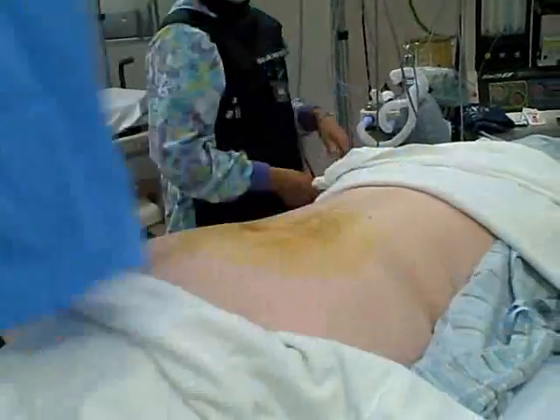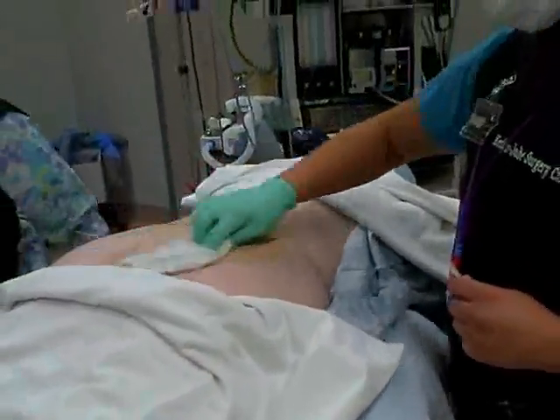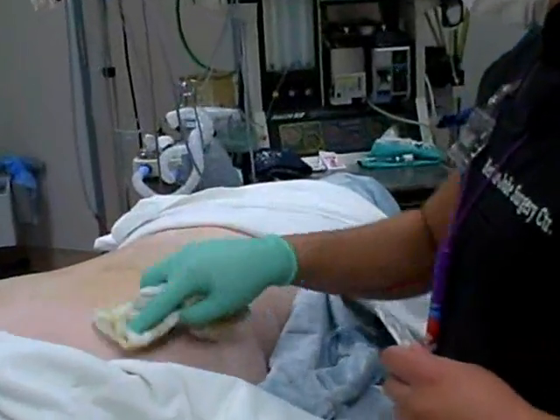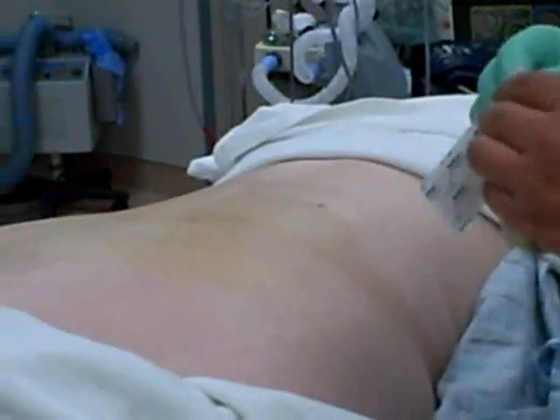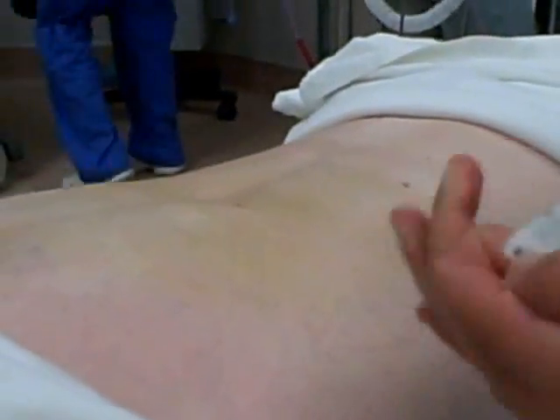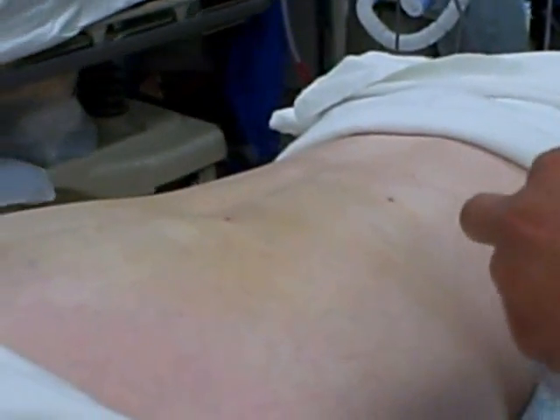remove the drape, and then wipe the excess cleaning solution from the skin. Following that, a Band-Aid will be placed over the injection site. The patient will be escorted back to the recovery room area where they'll be monitored for about 30 minutes. They're usually discharged with a pain diary so that they can record their pain scores over the next several days.